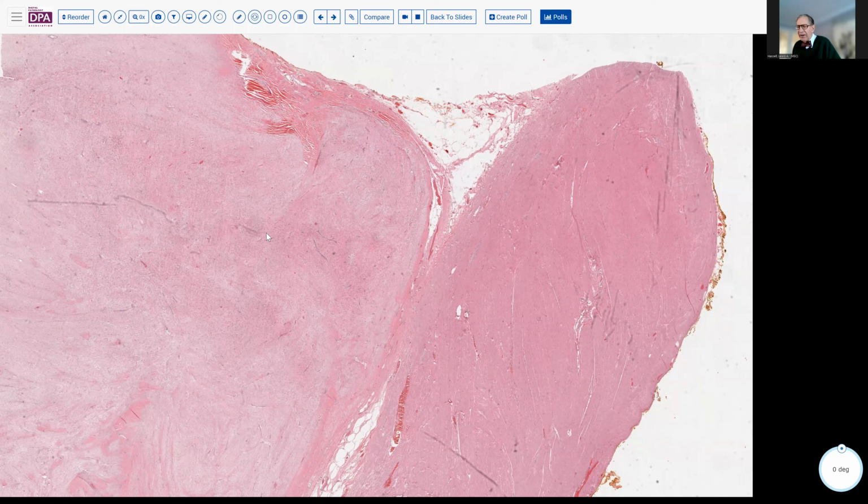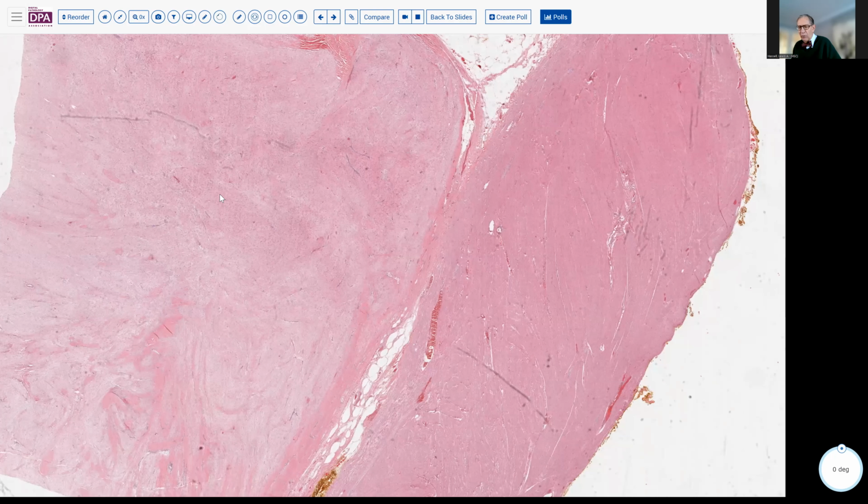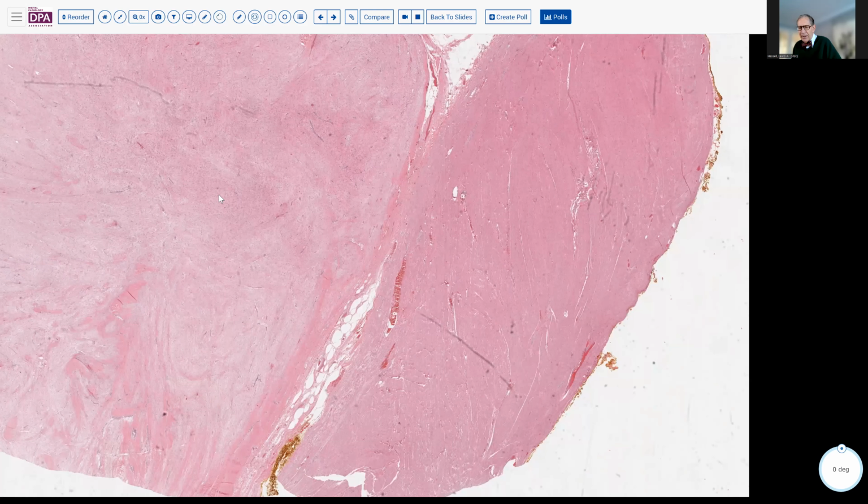They usually do not have any giant cells or anything like that. They're quite uniform cytologically. Intra-abdominally, that's probably more frequently seen with the APC gene or familial polyposis patients, whereas postpartum, that kind of lesion is more commonly seen in the abdominal wall or elsewhere.